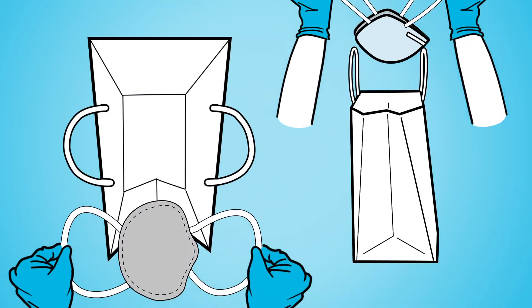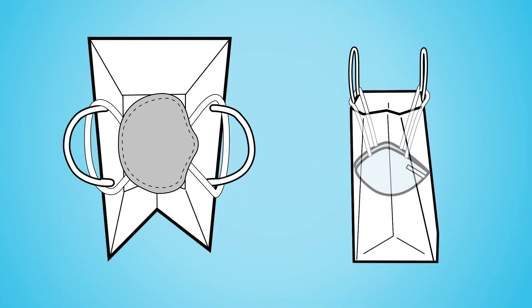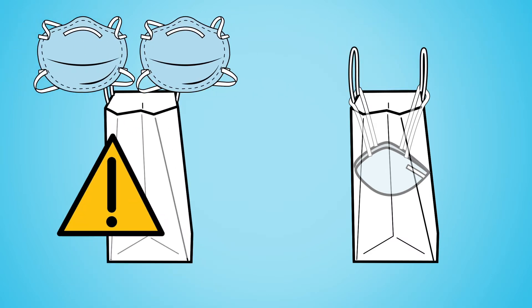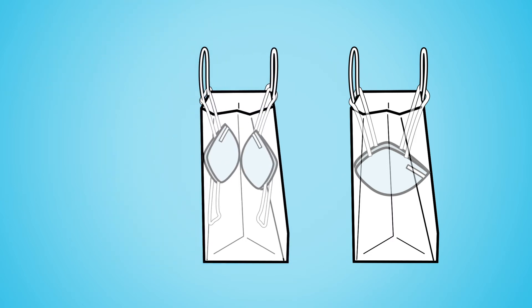You can loop the straps of the respirator over the bag handles so that it is held inside the bag. If you are alternating respirators and short on bags, you can loop the straps of a respirator over each handle so the outer surfaces face each other inside the bag.